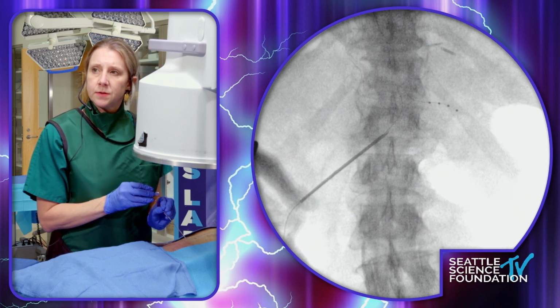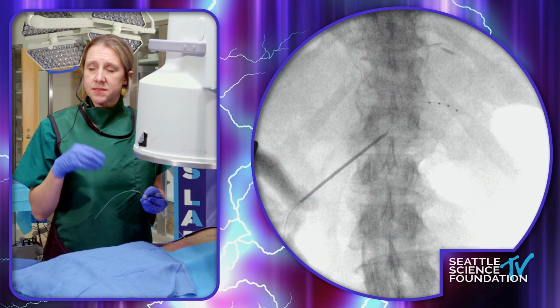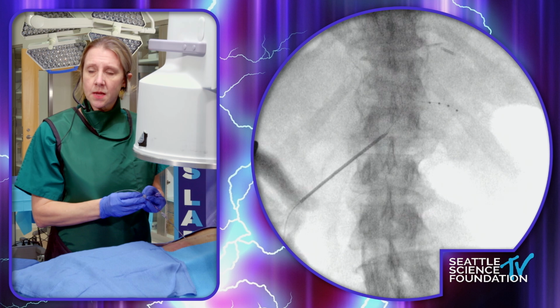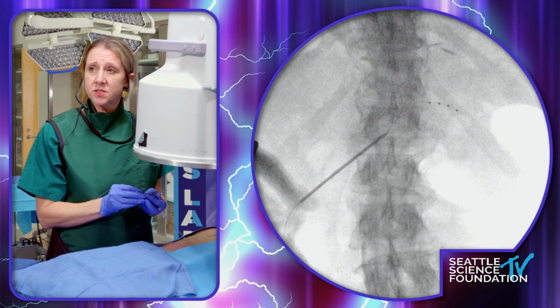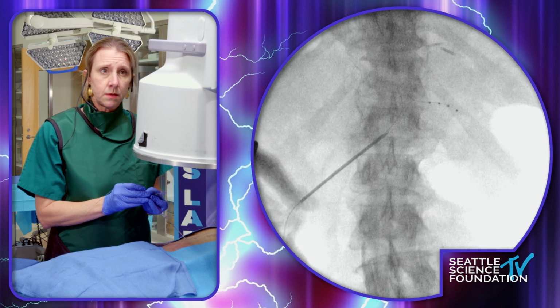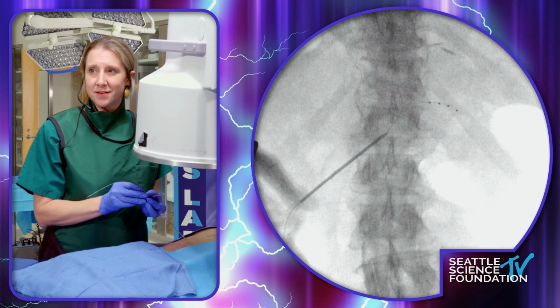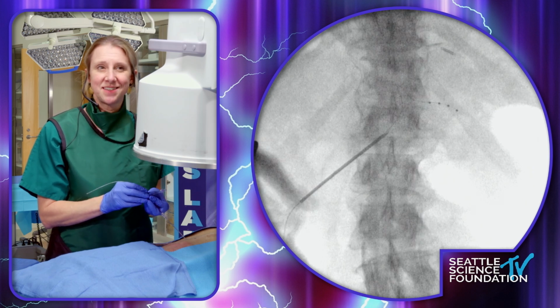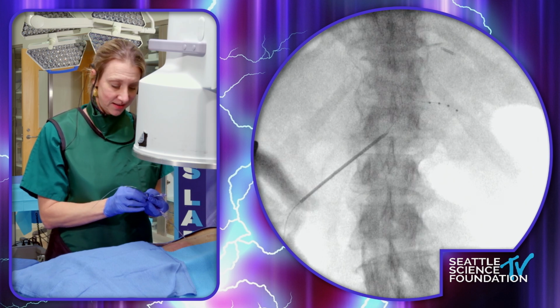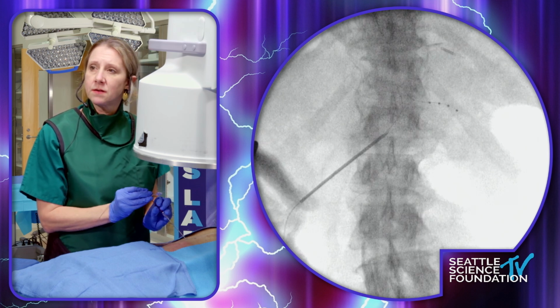So what I'm going to do now is advance. So what I'm looking at here is the contacts that, in my opinion, are just a little bit too far out the neural foramen. So I'm going to withdraw them, but I'm getting some direction from my very handy device representative that his suggestion is instead to advance the lead before I withdraw. Live.